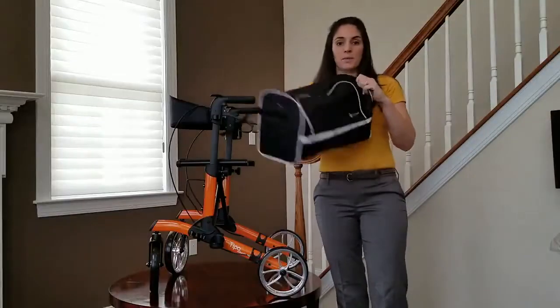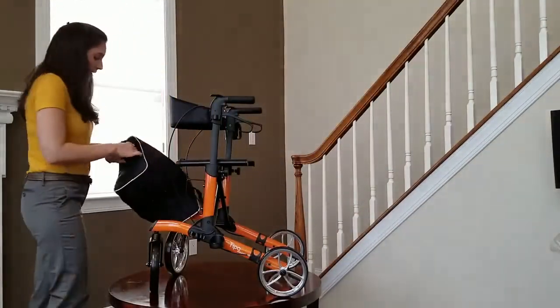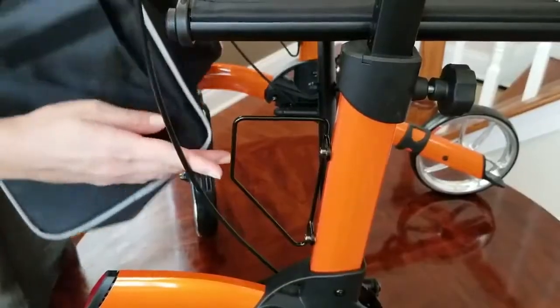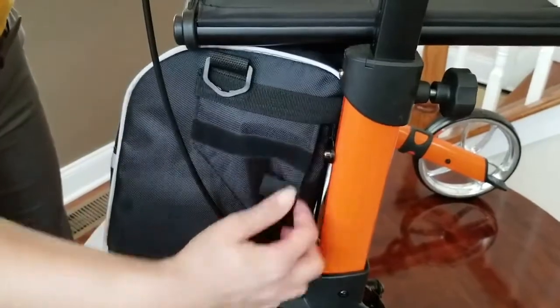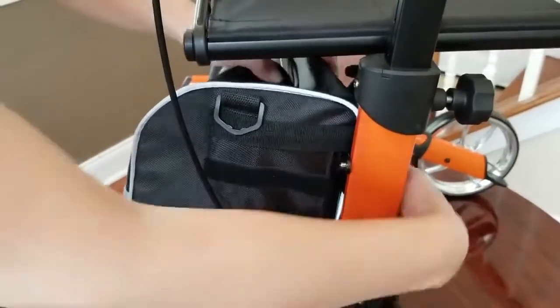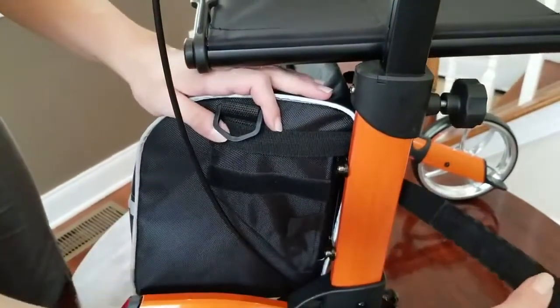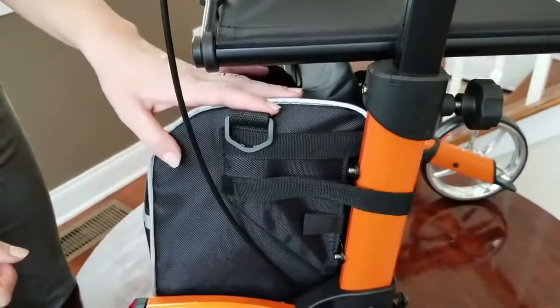Now, let's put in the shopping bag. Find the little pockets and put them into this metal frame. Make sure you put it all the way in, and then the strap goes around the frame of the walker, and then you use the Velcro on the front. Do the same thing on the other side.